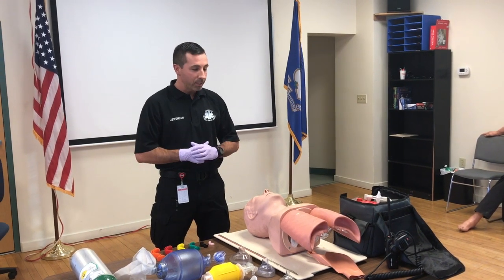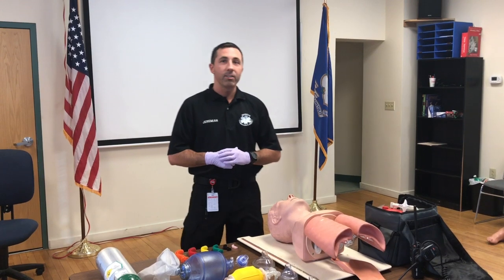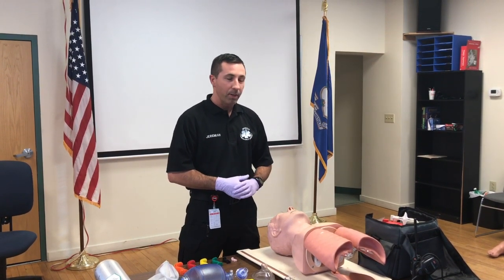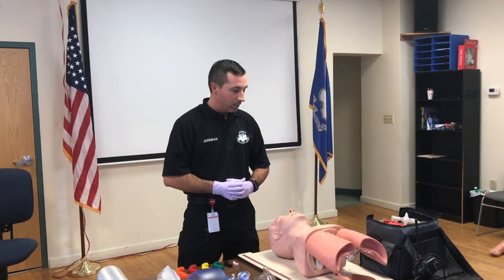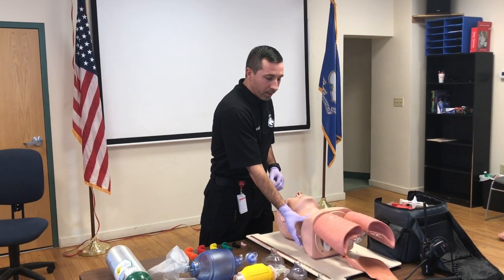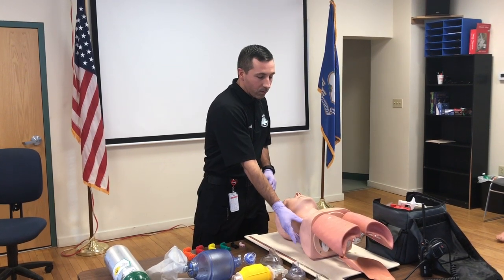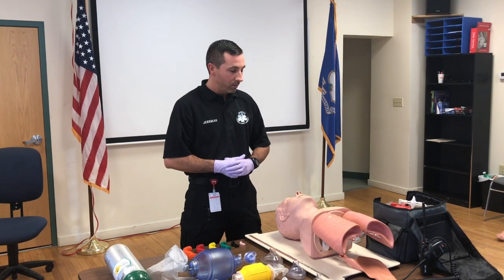My BSI is on. I'm checking to make sure my scene is safe. We're going to enter the scene and assess for responsiveness. So when I walk in, is my patient alert? Your patient is not alert. Verbal response. Sir, can you hear me? Your patient does not respond. We're going to perform painful stimuli by grabbing the trap. Patient does not respond. So my patient is unresponsive. At this point, I'm going to activate EMS assistance.